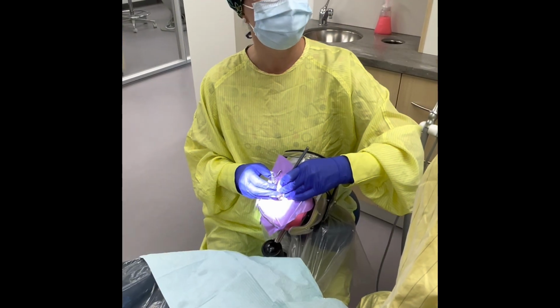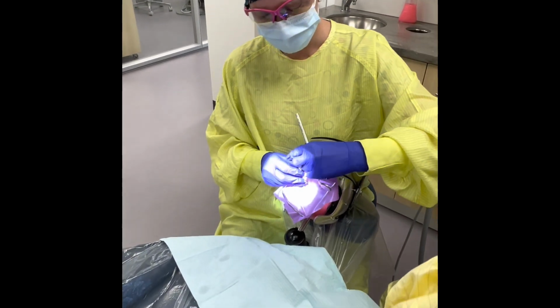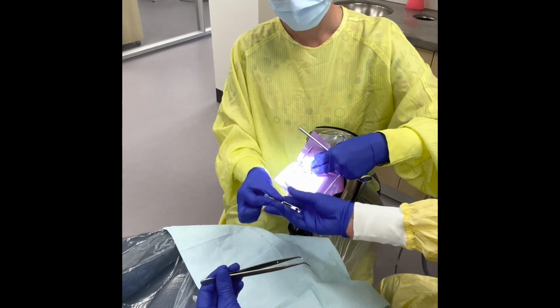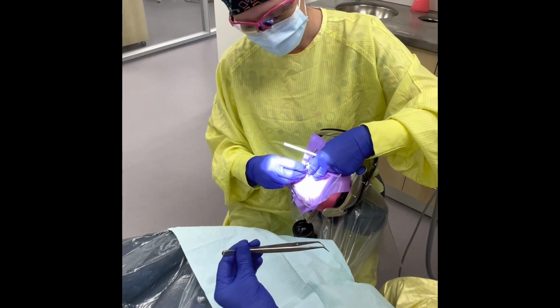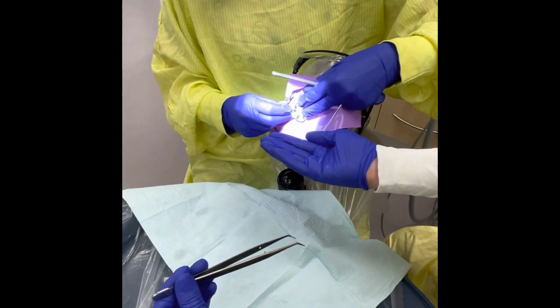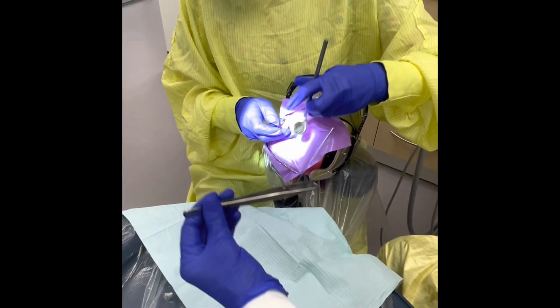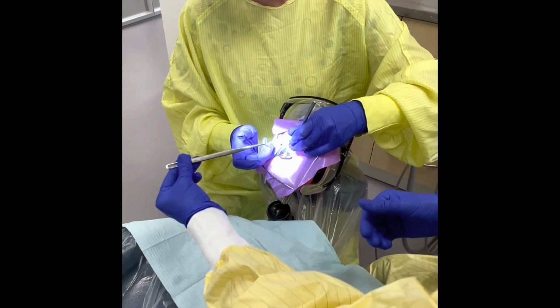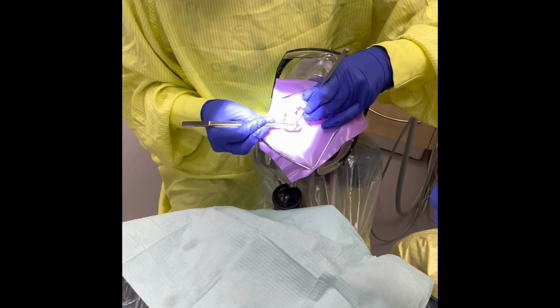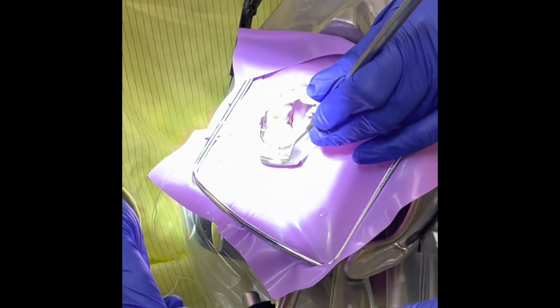Okay, I'm going to remove my Tofflemire now. All right, so I will do the outer knob first. Get that to Stacy, and then I'm going to remove my matrix band. Careful to remove the mesials first or last, as that is my preparation. I'm going to come in with the intraoral pliers, and Amanda will remove her wedge. I'm going to palm it to Stacy so she has that.